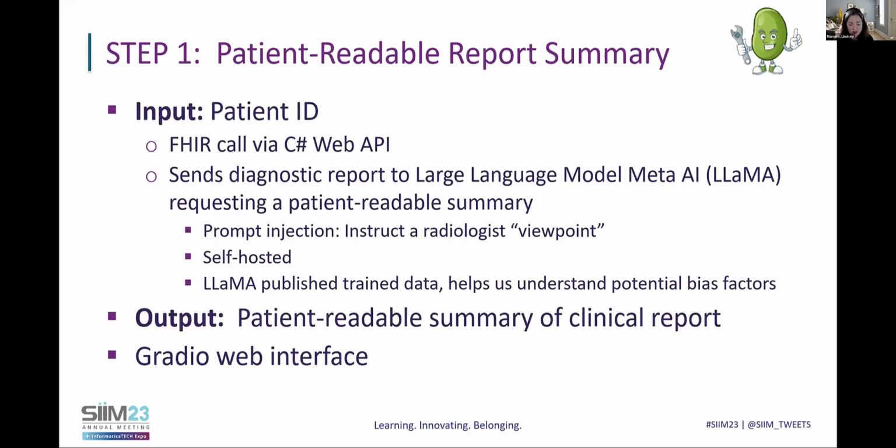We use prompt injection for this. So basically we say, hey, we are a radiologist, but we want to summarize the report. And it is self-hosted. No additional training was done in this case, but we wanted to see out of the box what LLAMA could do for us. And the output is, again, a patient readable summary of a clinical report. We did use the Gradio web interface for both of these solutions.